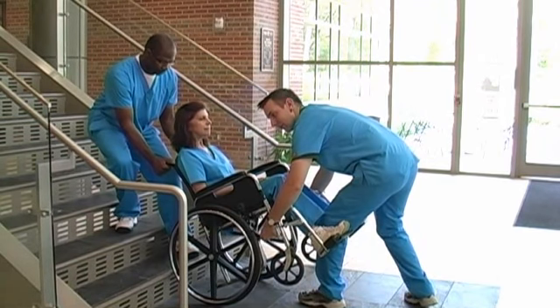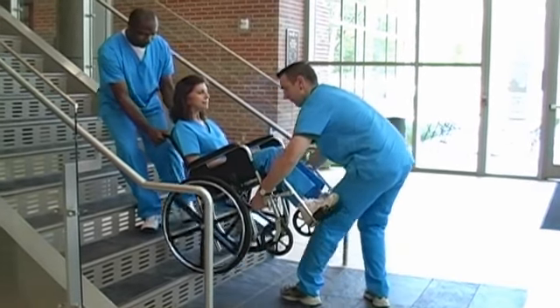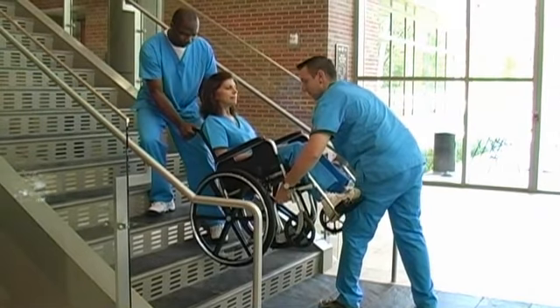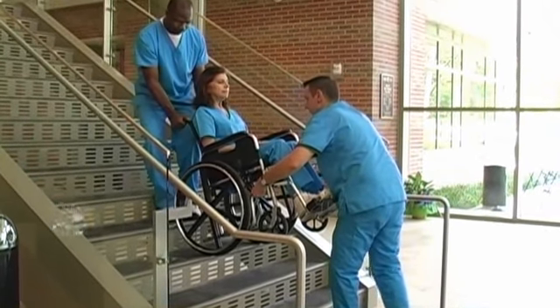Standing with one foot forward and knees bent, they slowly lift the wheelchair up the steps. Then one person holds the wheelchair while the other person moves to the next step. Working together, they continue to lift the wheelchair up the steps.